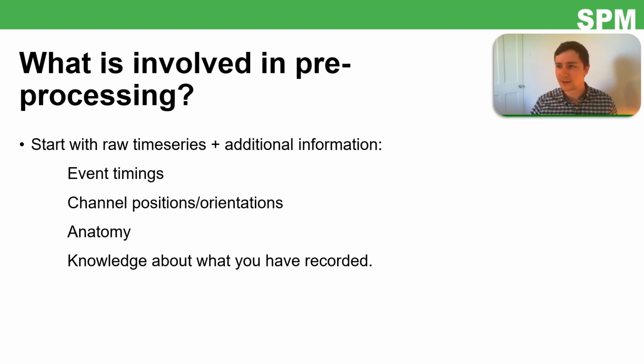And you may also have knowledge about the anatomy you've been recording from and where that is in relation to those channels. Anyway, the most important thing that you'll have is some knowledge about what it is you've actually recorded. It might seem kind of obvious, but that's going to guide all of your pre-processing as well as your analysis.